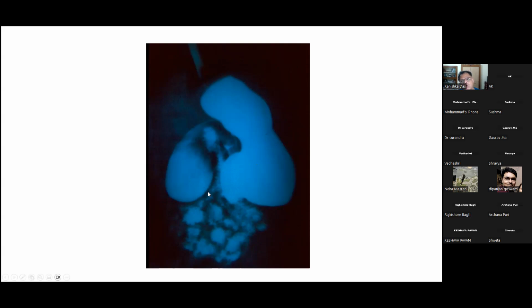When you were saying about this hole, how do you identify this hole? Sir, we can do an enterotomy and pass a Foley's and fill the balloon, hitch it to see where the hole is. Where will you do the enterotomy? Here in the duodenum? No, stomach side, sir. You'll do it in the stomach, put in a Foley's, then inflate, hitch up and withdraw.